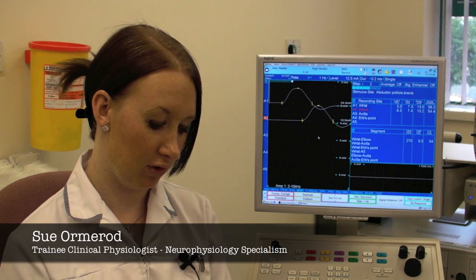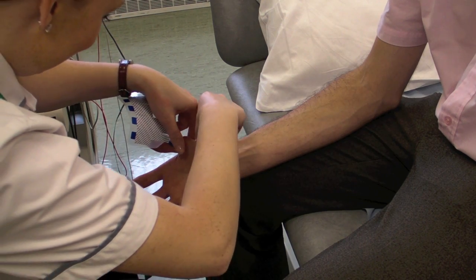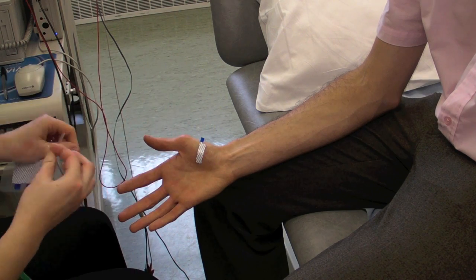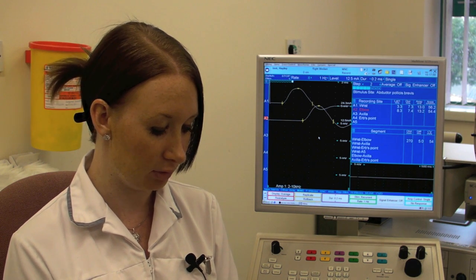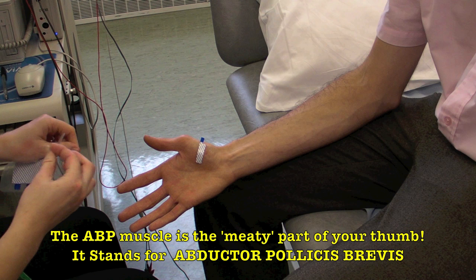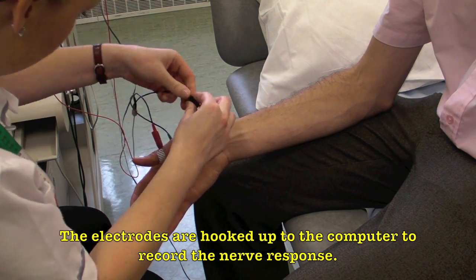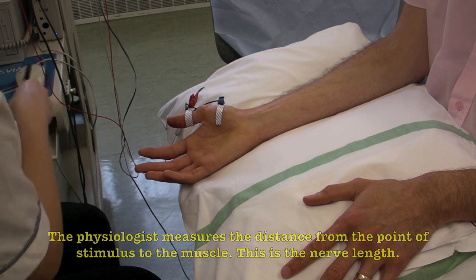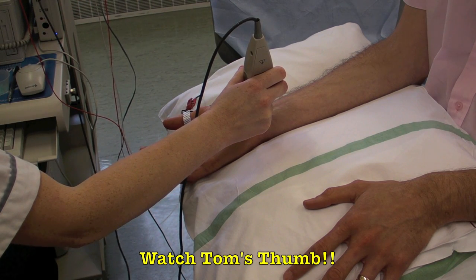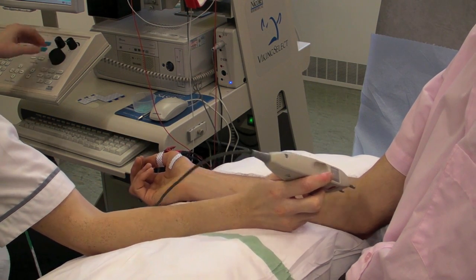We pop three sticky electrodes on: one on the back of the hand which is a ground electrode to make sure the patient is grounded. We also pop one sticky electrode on the APB muscle, which is just underneath the thumb, and also one little electrode off the muscle, just above the thumb, further up from the APB muscle. From that we stimulate at the wrist and also stimulate further up at the elbow crease along the median nerve pathway, which gives the thumb a muscle twitch because you're actually stimulating the muscle.